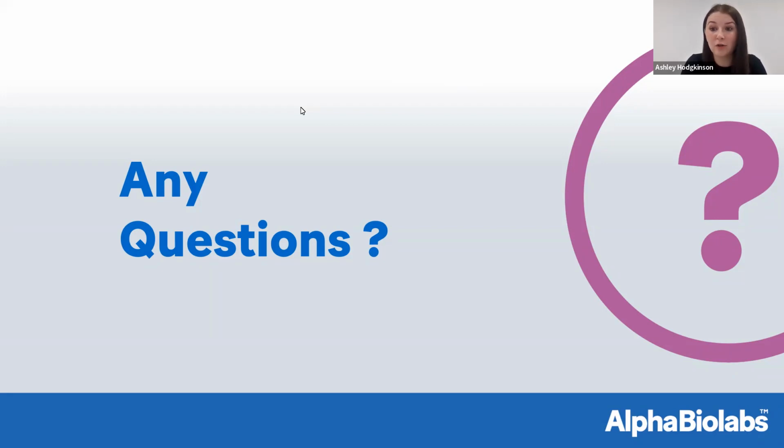And it's not a question that we ask on the form either about their ethnicity, because I've seen that as one of the questions too. It's a standard average growth rate set out by the Society of Hair Testing. So we follow their guidelines, and it's them who make sure that we're testing accurately. So it would be the same for all ethnicities across the board.